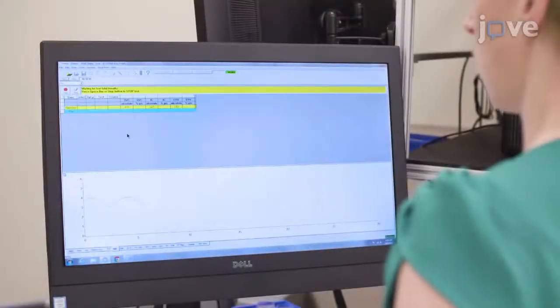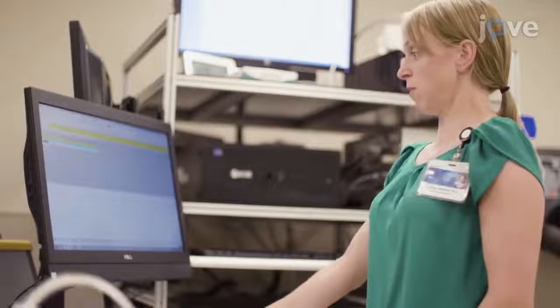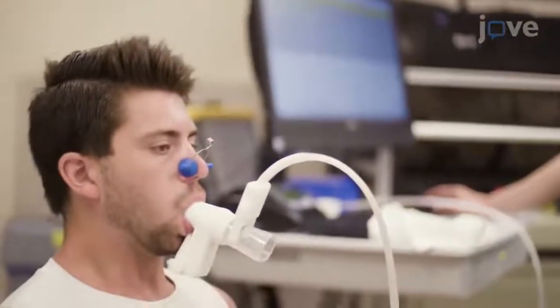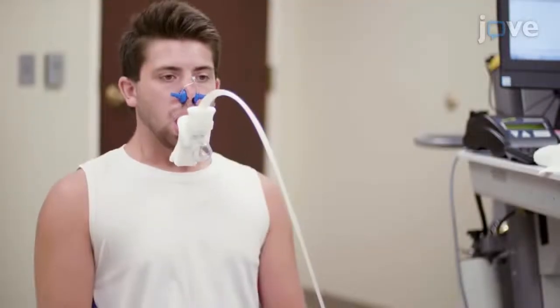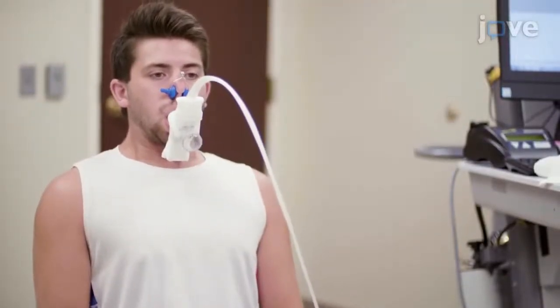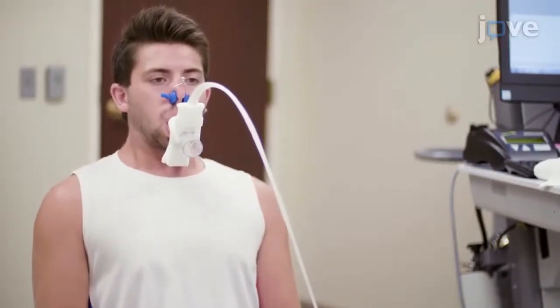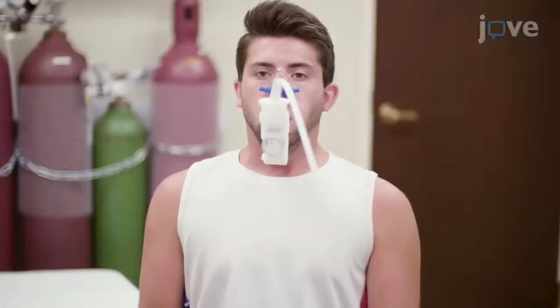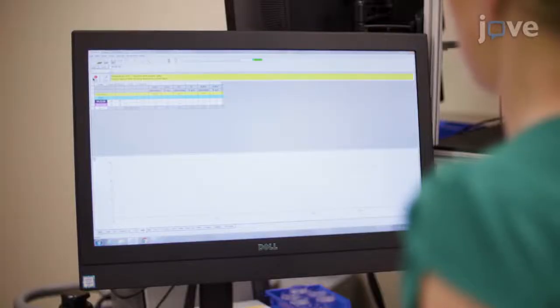Start the maneuver on the software and instruct the subject to continue to breathe normally. Then, ask the subject to inhale maximally and then exhale slowly until there is a plateau in the flow tracing. At this point, instruct the subject to take a maximal breath in. Lastly, stop the measurement and allow the subject to release the mouthpiece.